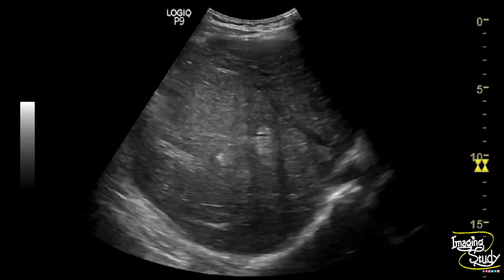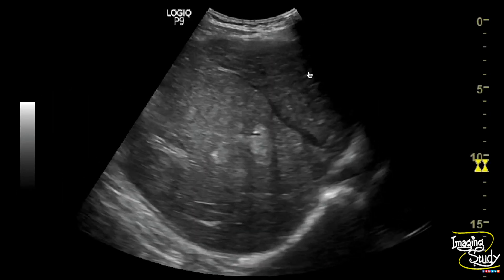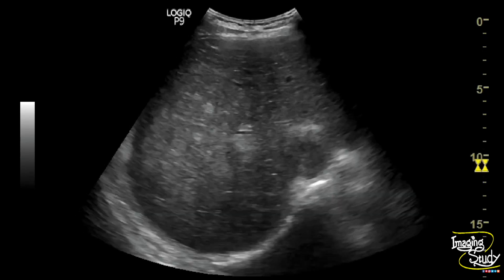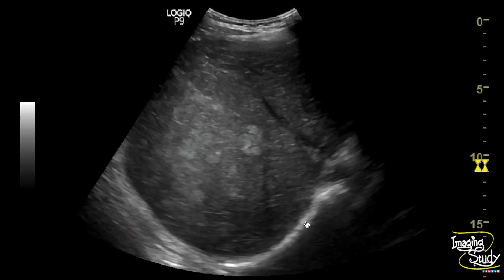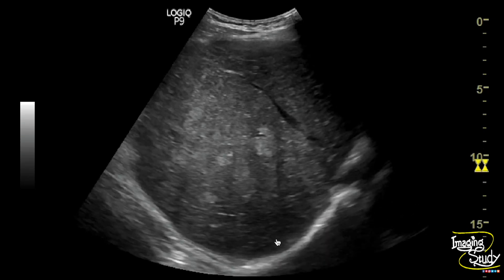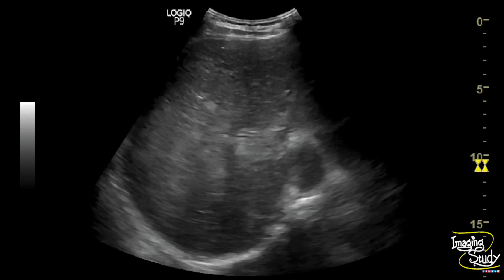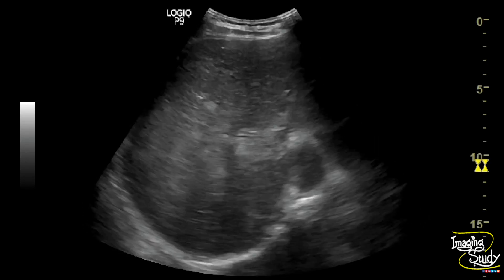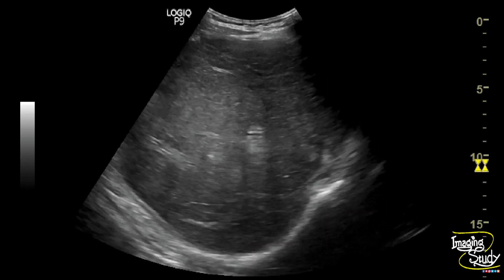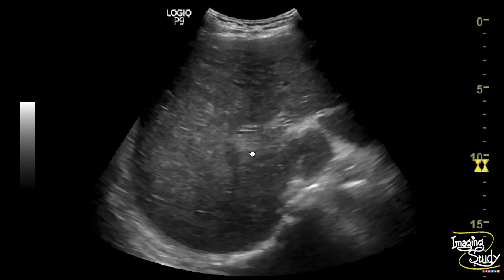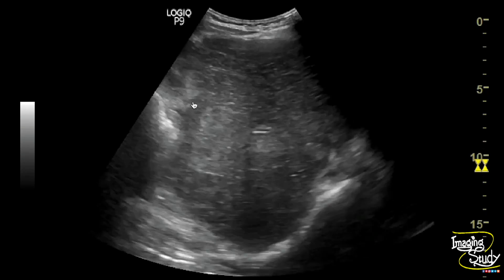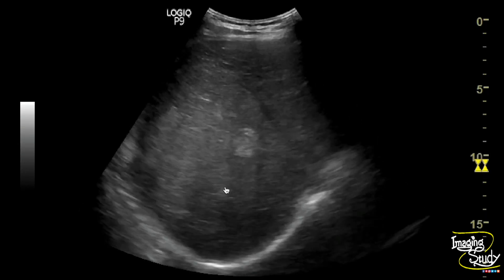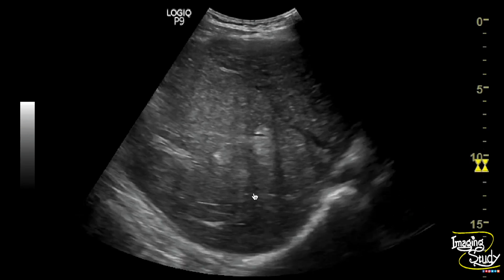Here you can see the right lobe of the liver showing an irregular ill-defined heterogeneous space-occupying lesion. The surrounding hepatic parenchyma looks coarse. This coarse parenchyma with space-occupying lesion indicates a case of hepatocellular carcinoma on the background of chronic liver disease. You can also see multiple hyperechoic space-occupying lesions adjacent to this large SOL, which may indicate segmental metastasis.